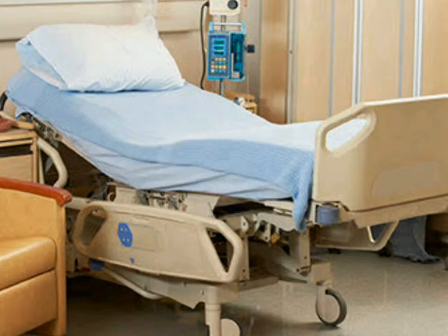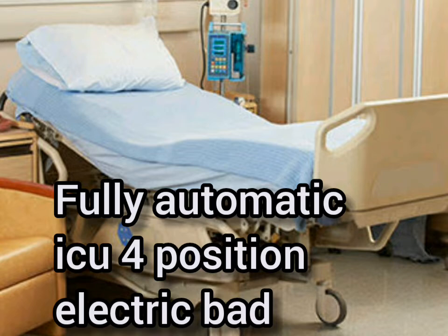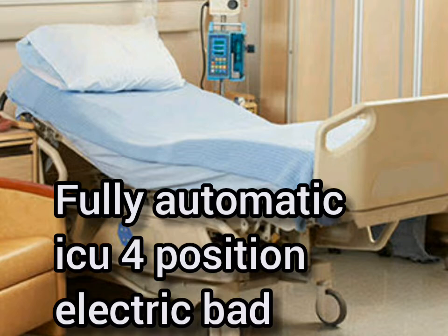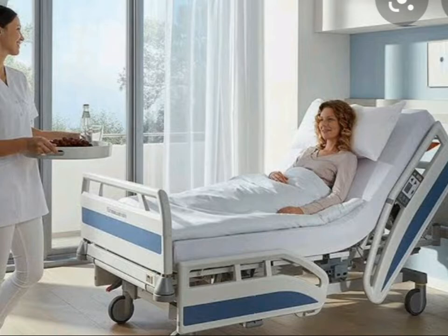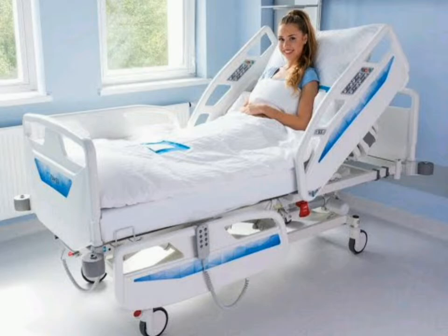Number twelve: the fully automatic electrical ICU bed is most important in the ICU. It helps patients and staff with easy position adjustments — leg up, leg down, body up — making it convenient to position patients comfortably.